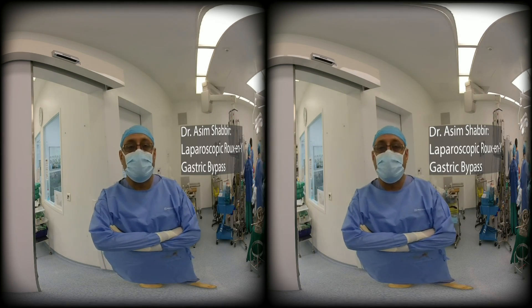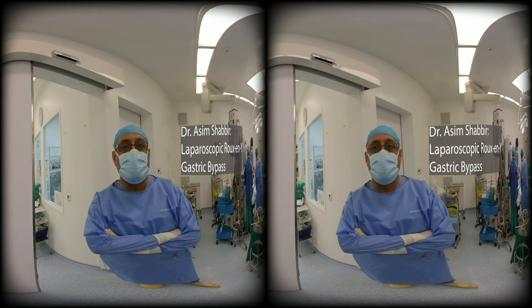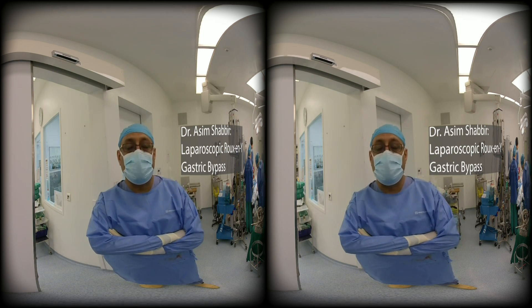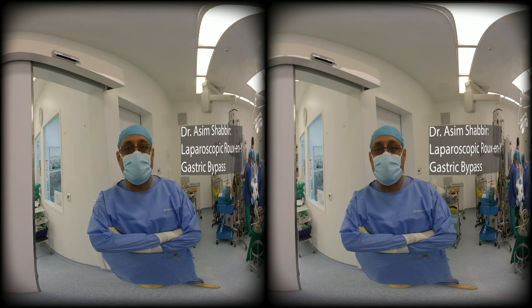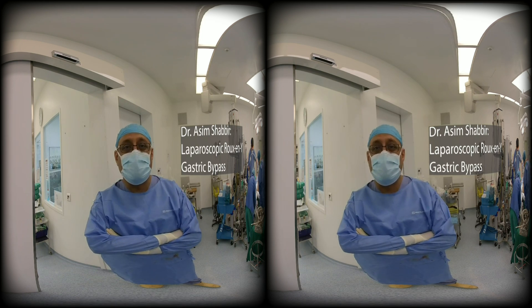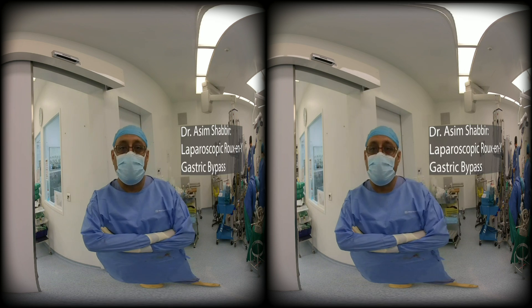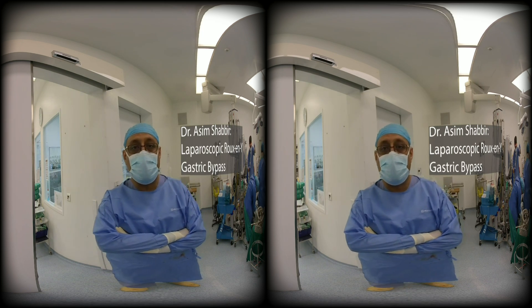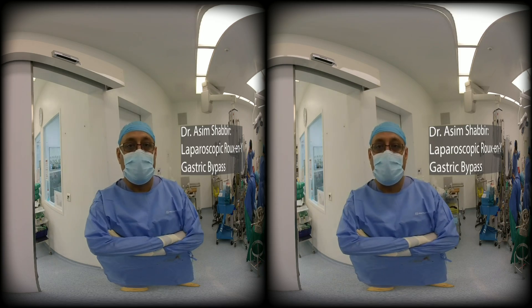This is a 56-year-old lady with type 2 diabetes, hypertension, and hyperlipidemia with a BMI of 38. She's undergoing a Roux-en-Y gastric bypass today. The indication is morbid obesity and type 2 diabetes. We've had her achieve a preoperative weight loss of about 4 kilograms. We'll see how the liver looks today and proceed through surgery.